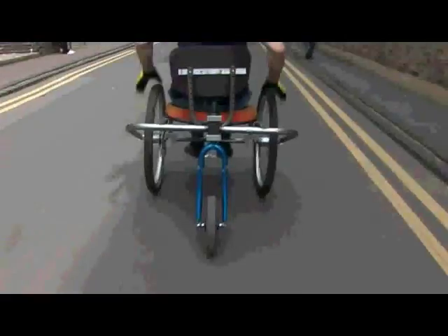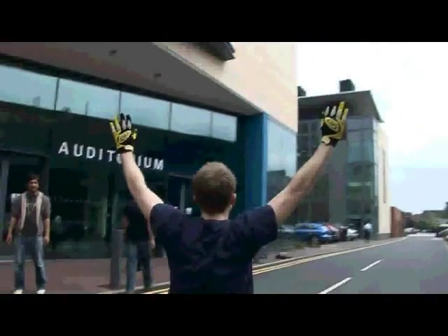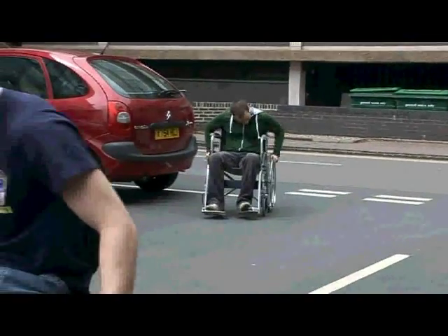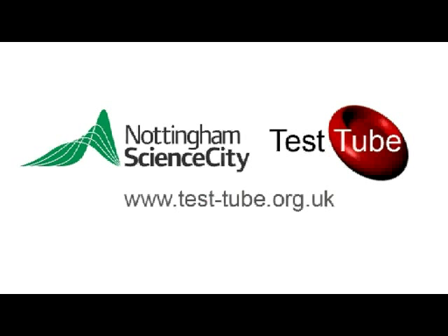How's it riding mate? It's good, it's good. It's got a nice ride. How's the other one doing? There we go! It's good — more time, more time.